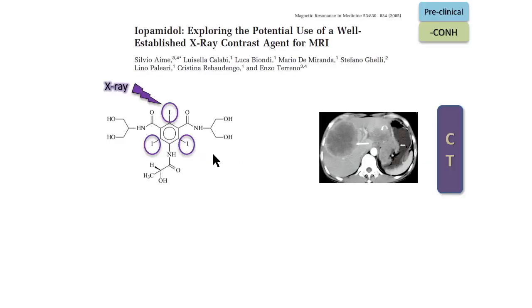One of the parameters in which I was most interested is pH. So it's nowadays possible to map pH. In order to have a system that could be immediately translatable to clinical application, we thought of iopamidol, from whose structure it is possible to see that there are several kinds of protons that may be involved in exchange with water.